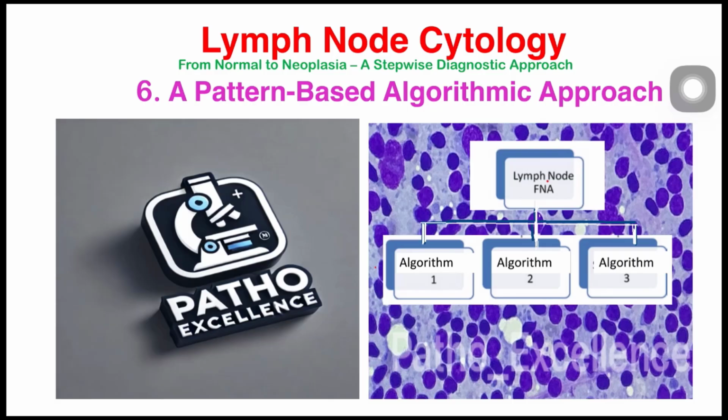As we know, when we look at a lymph node FNAC smear, one of the biggest challenges is the wide differential diagnosis, ranging from reactive conditions and infections to lymphomas and metastatic malignancies. So for many PG students, the difficulty is not in recognizing individual cells, but in answering a more important question: where do I start?